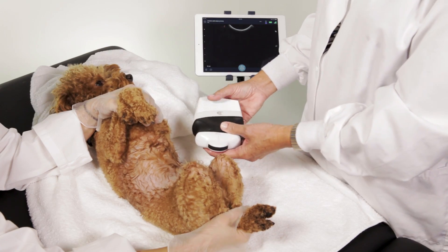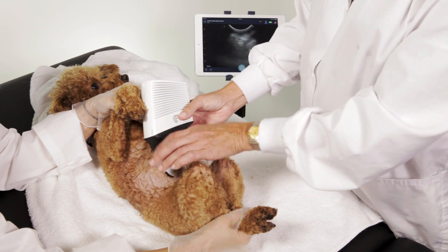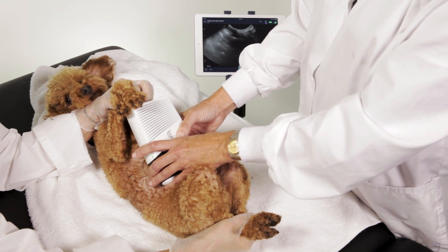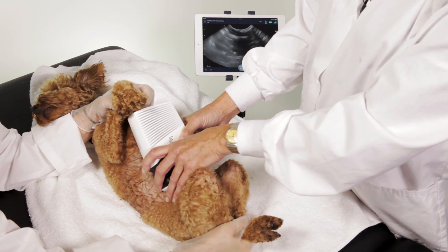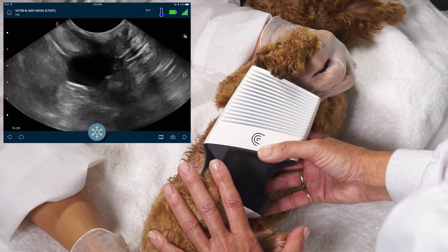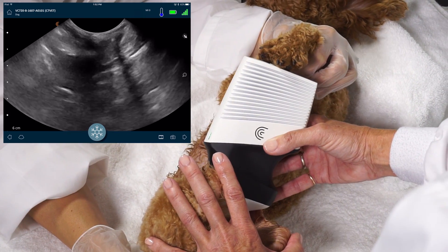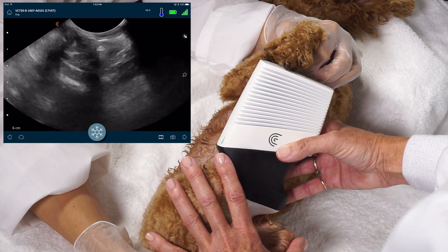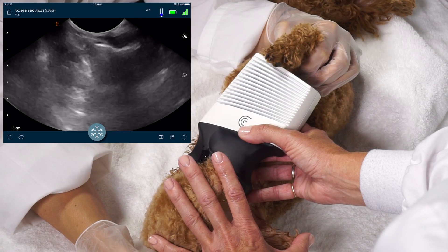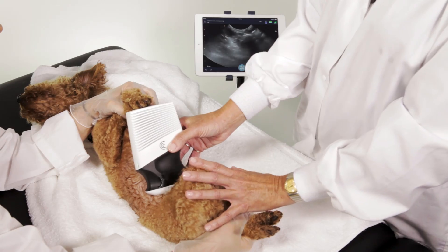The last area we're going to examine is called the cystocolic area. This is where the bladder lies. We're going to angle way down into the area. In this case, we don't have hardly anything in our bladder, but that doesn't matter — we don't see a sliver of fluid in between any of the organs here. We're also going to lean over to the patient's left side, the paracolic gutter, scan all the way through in transverse, then angle over to the patient's right side and scan all the way through. If there was fluid here, we'd see loops of bowel surrounded by black.